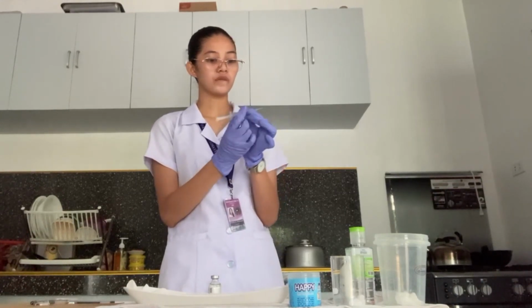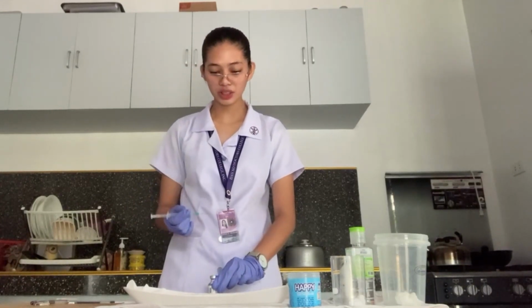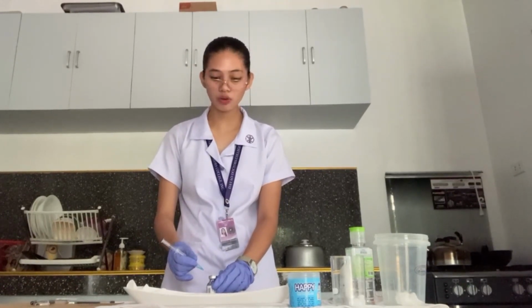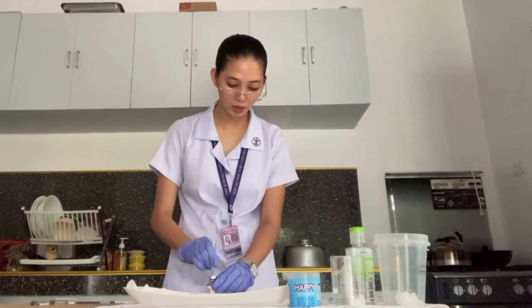Okay. After that, we're going to position our syringe in a 45-degree angle, making sure that the bevel is facing upwards. And then poke it into the rubber cap, like so. And then depress the air into the vial.